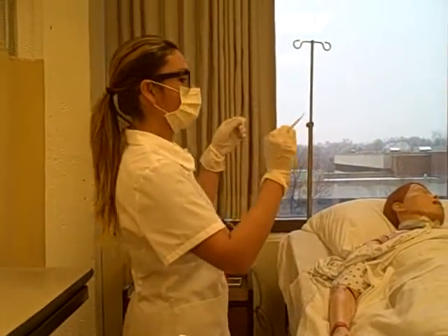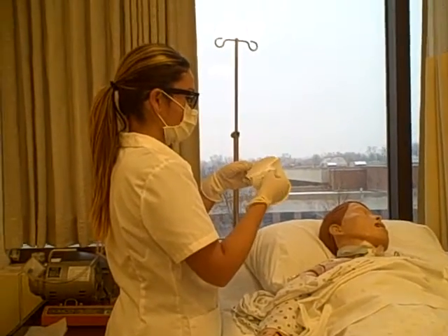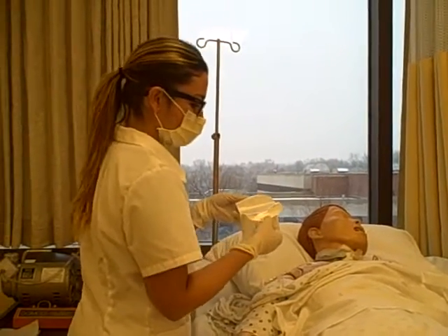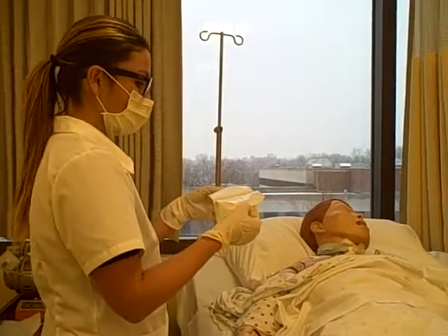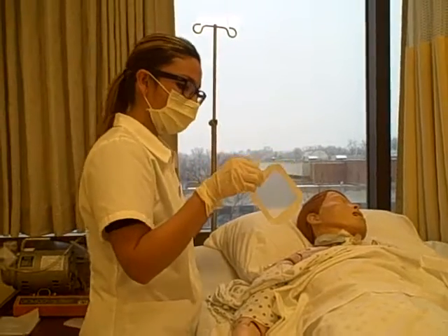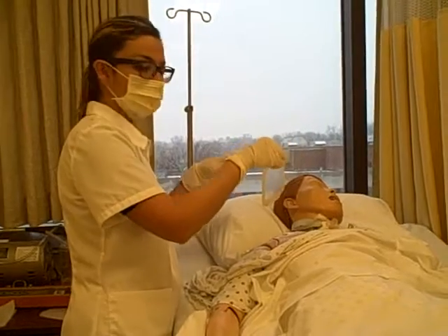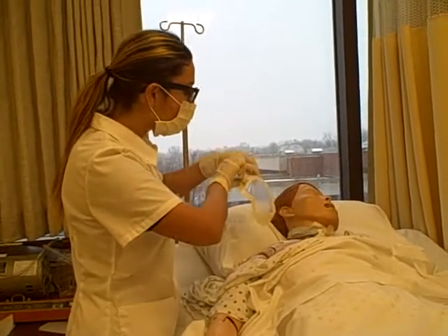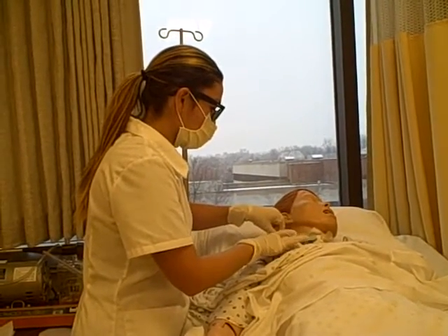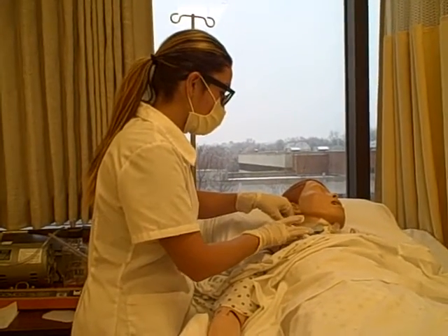our new little sticky dressing. For the purposes of this validation, there would be a slit where the port tubes would be fed through, but since we don't really have one of those, we're just going to demonstrate it with a regular one. We just have to make sure that the window, we can see the site. So then our tubes will be fed through the little slit. We're just going to push down carefully to make sure that we don't have any air bubbles around it.